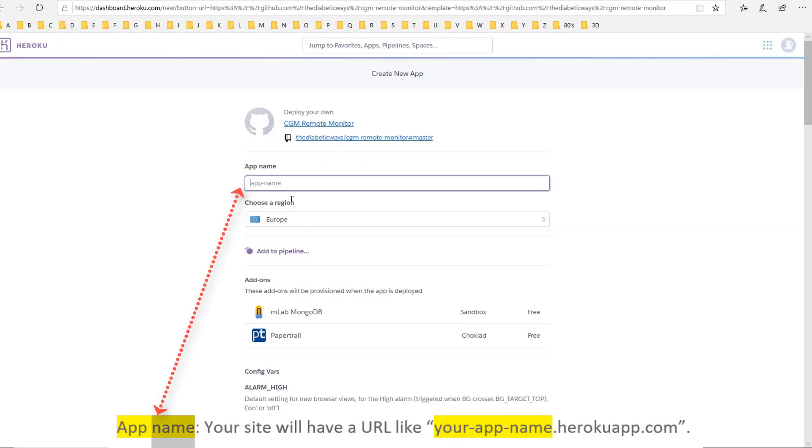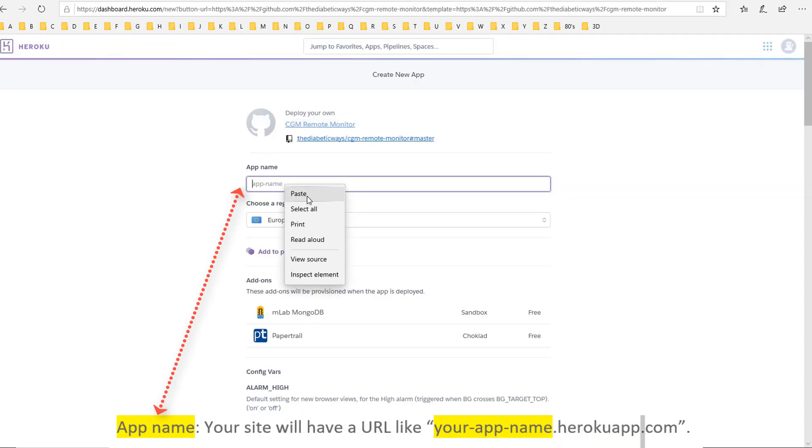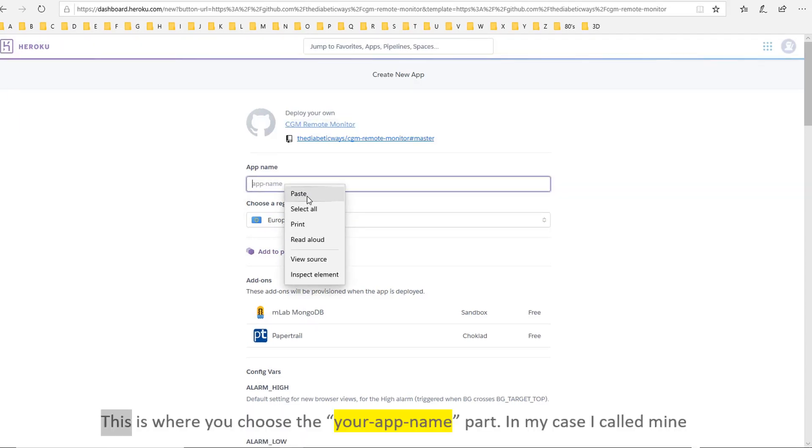App name: your site will have a URL like yourappname.herokuapp.com. This is where you choose the your app name part.